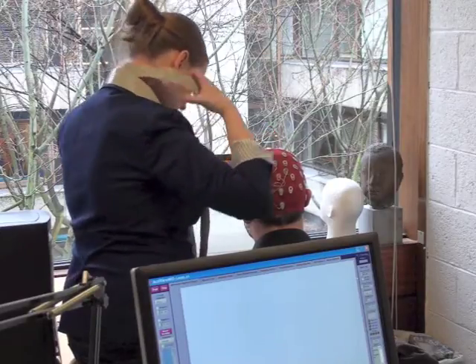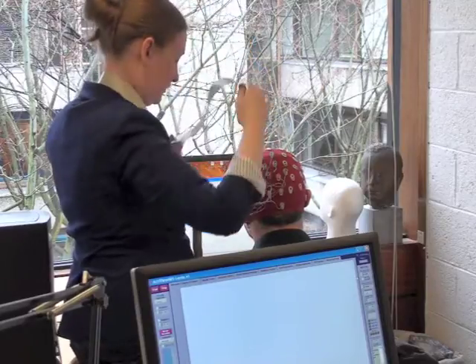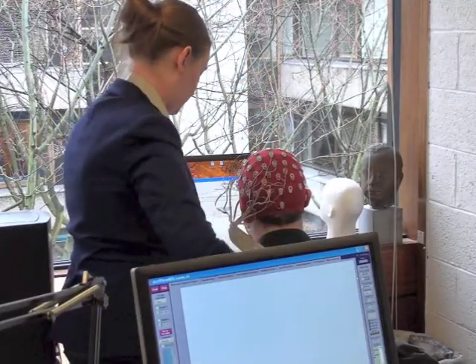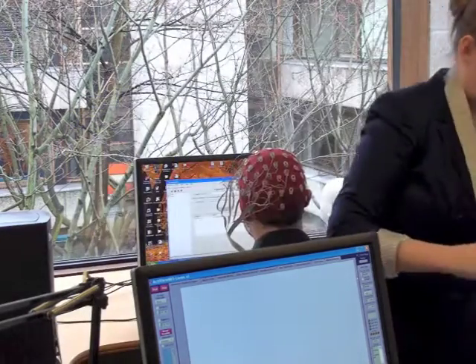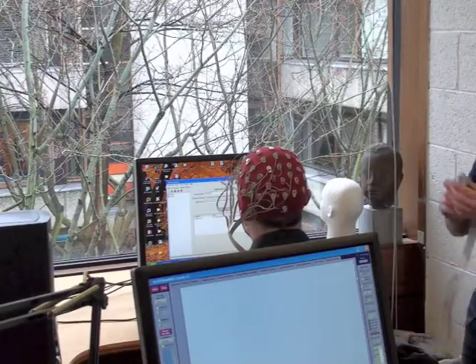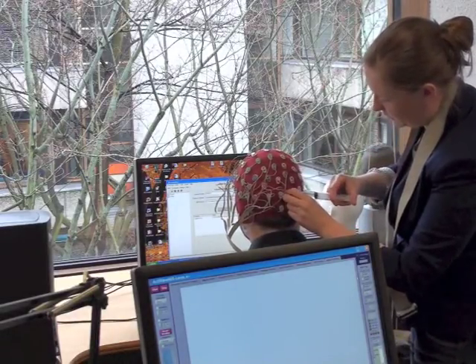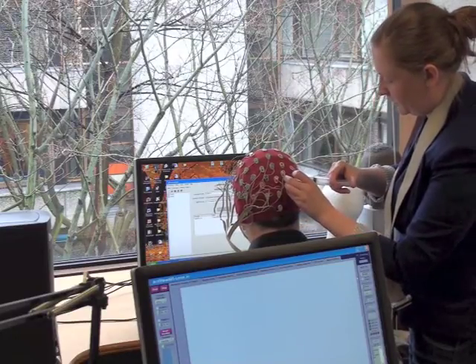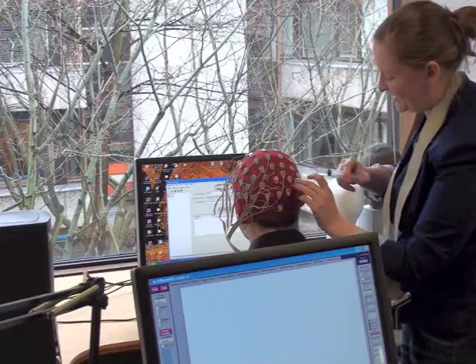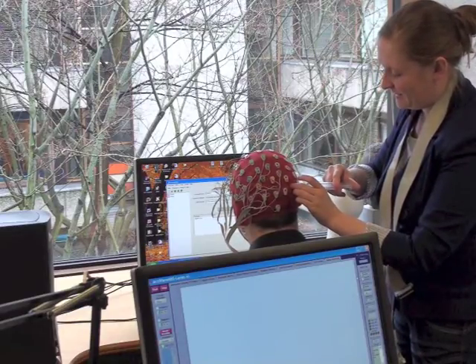Okay. Take this one, and I'm just going to leave it on your shoulder there, Bren. Is that okay? Yeah. Okay. Now I'm going to do the right side. Okay. How are you finding it, Bren? It's fine. I could look into everyone's offices over here. Yeah, it's good, isn't it? Where are we now?